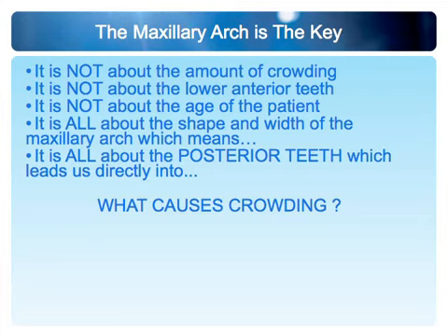So age is not so much of a factor as to whether or not I'll start an Invisalign case. If you have that stable, healthy periodontal structure to work with, and the patient is interested and willing to do Invisalign, then certainly it will provide a benefit to them. So now let's take a look at what it is about. It's all about the shape and the width of the maxillary arch. And what I mean by shape and width of the maxillary arch is, do we have proper arch form and proper arch width? And that's where we're headed with this next segment.